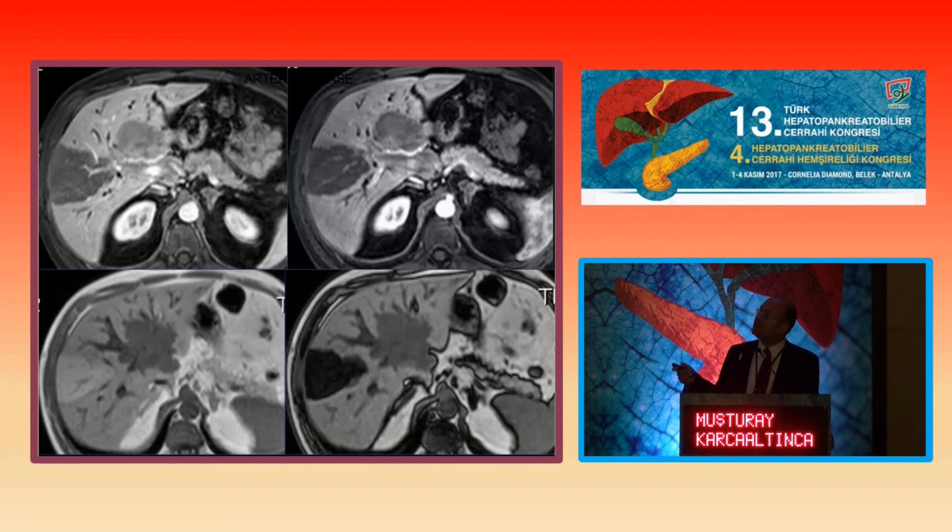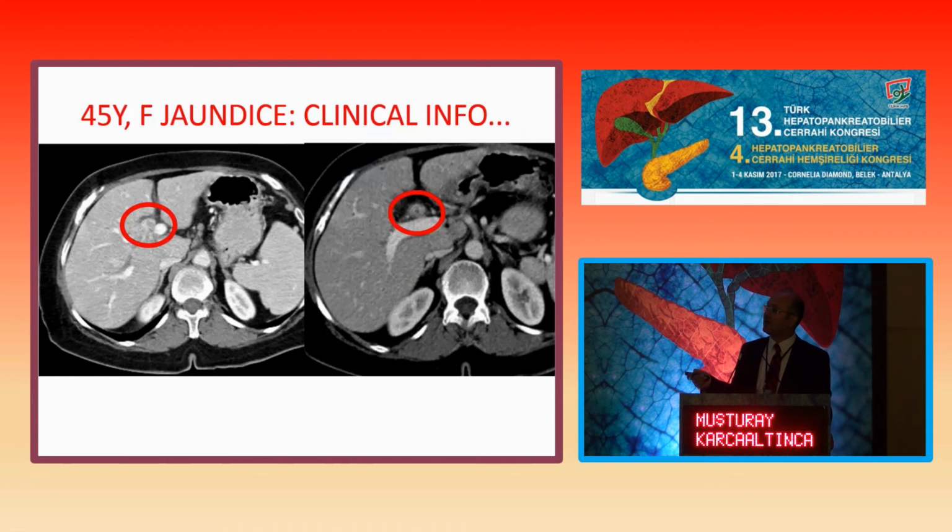So I want to show you this patient, which was an intrahepatic cholangiocellular carcinoma. So our residents were concerned about this, if this was a mass or not, but this was not a mass. It was a focal fat, due to changing of perfusional and biliary drainage pattern.